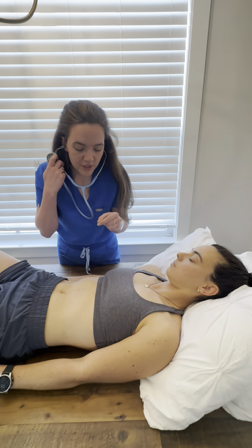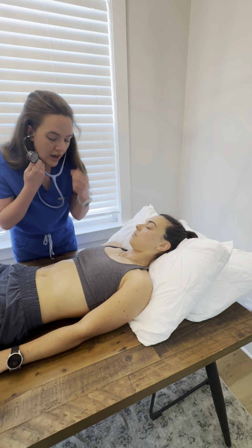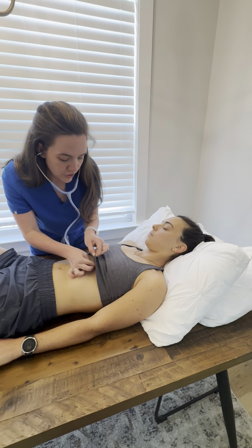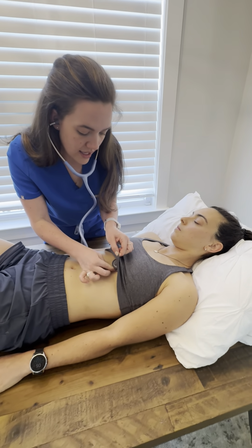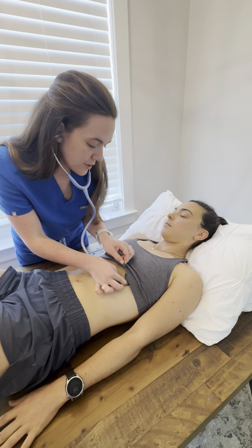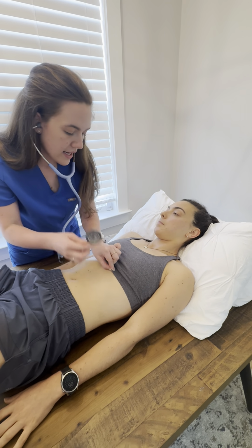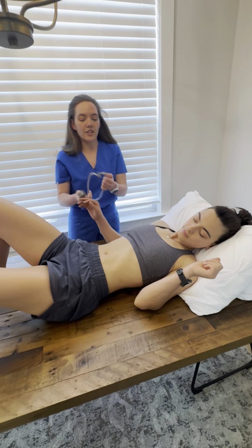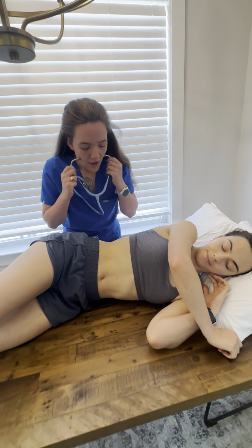Okay, now I'm just gonna move my stethoscope to the bell and we're gonna listen again for the tricuspid and mitral in that 4th intercostal space. And then 5th intercostal space, left sternal border. Perfect. And I'm actually gonna have you turn on your left side. I'm gonna listen to your mitral valve because this just brings the heart closer to the chest wall.